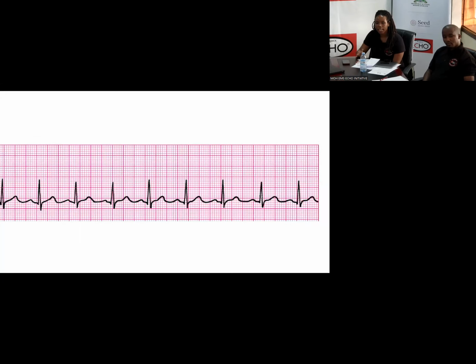So when you're looking at an EKG strip, the first thing we want to figure out is the heart rate. Most monitors give you the heart rate or it's written at the very top. But if you wanted to know quickly how to get a heart rate, you take 2 R waves, which are the tallest peaks of the QRS complex, and you count the large boxes between them.